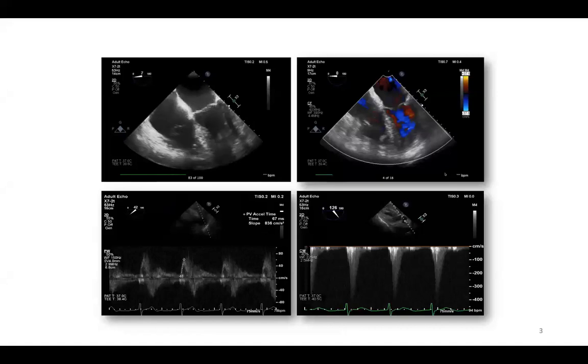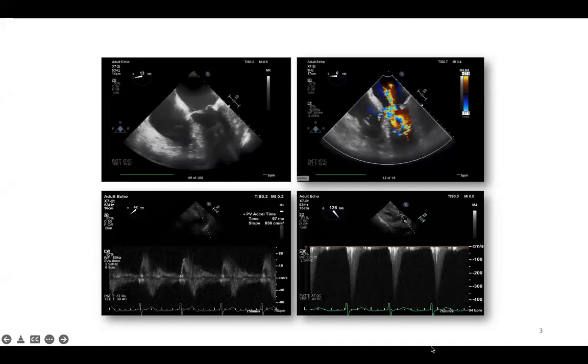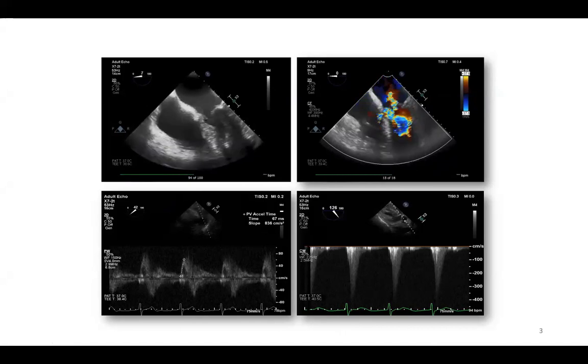Because of the poor quality of the transthoracic windows, we had to do a transesophageal echo for this patient. The patient was intubated and ventilated. We performed this transesophageal echo study, and you can see in this TOE that the left ventricle is hyperdynamic, which confirms what we saw on transthoracic echo. And you can also confirm that the RV is impaired. And you can see a degree of mitral regurgitation at this mid-esophageal four-chamber view.